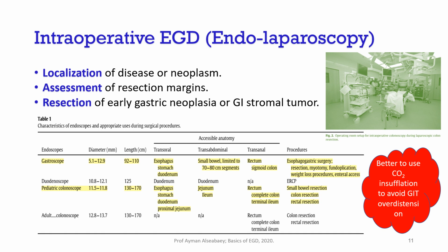This is localization. Also, if you have a patient with Dieulafoy ulcer, of course, as you know, if you find a case of Dieulafoy ulcer, you should apply a clip beside the Dieulafoy lesion or do black ink injection to notify the surgeon of the possible site of the blood vessel, especially as there is high liability for bleeding. Okay, if you didn't do so and the patient has uncontrolled bleeding, you will do intraoperative EGD to try to localize the site of the artery itself.